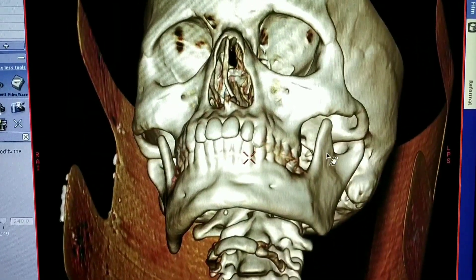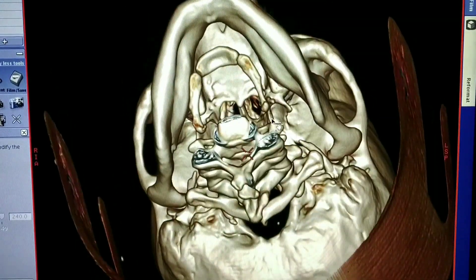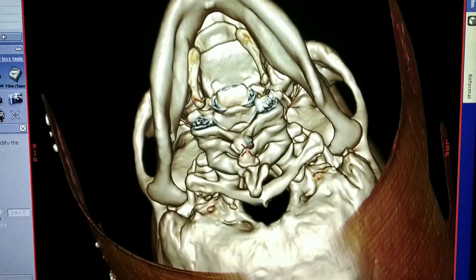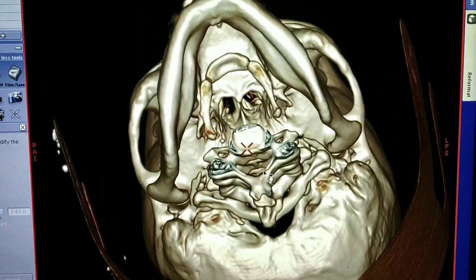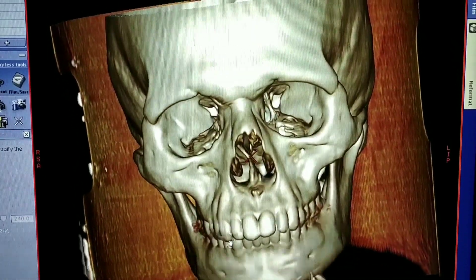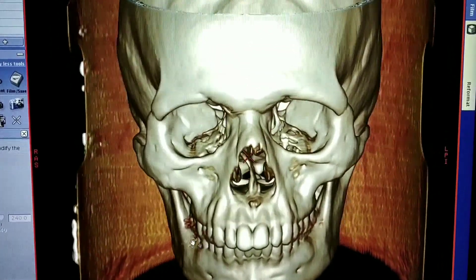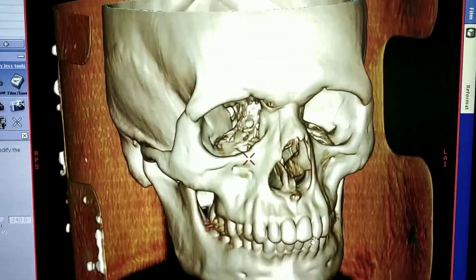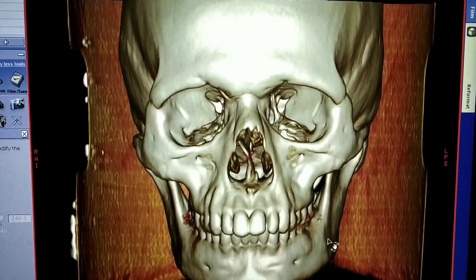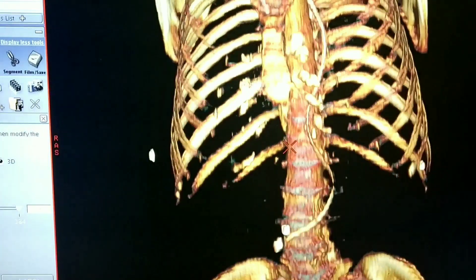The scans are then stacked one on top of the other by the computer, and adjacent selected pixels are joined to form a surface rendering. This image is assigned a surface shading by a virtual light source. Those pixels close to the light source are brilliantly illuminated, whereas the distant ones are suitably shaded. Pixels perceived to be located behind other opaque pixels are not displayed. This play of light and shadow is responsible for creating the three-dimensional effect.